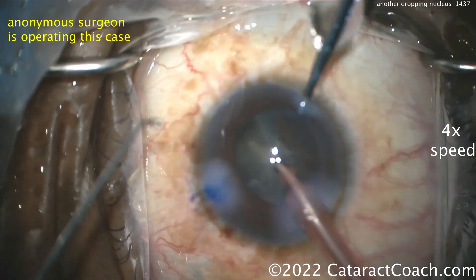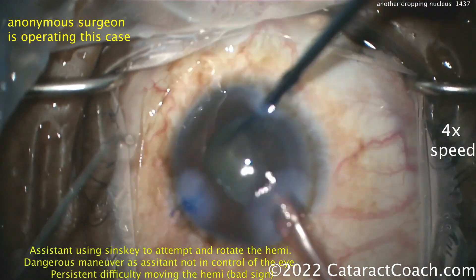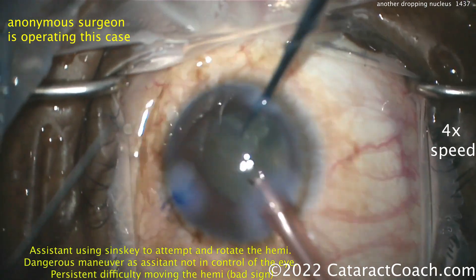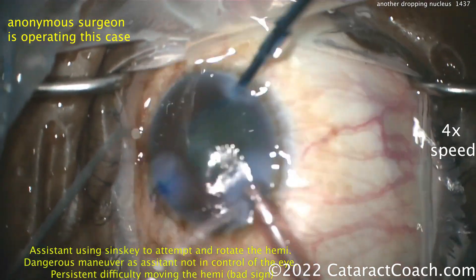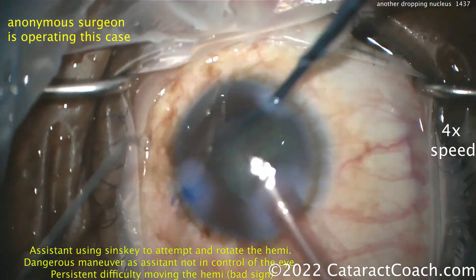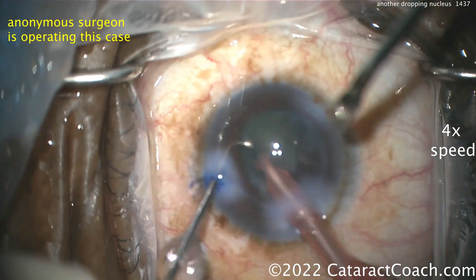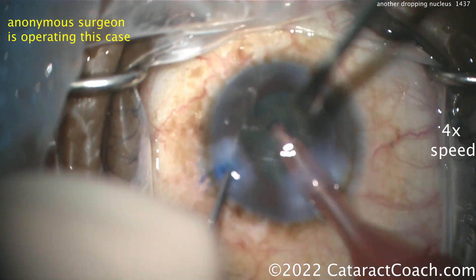Look at that red reflex too — it's a little too clear. The assistant now uses a Sinsky hook to help rotate the nucleus, but that's pretty dangerous since the Sinsky doesn't really control the eye. You still can't move that nucleus around, so that's not the greatest idea. At four times speed you can see just how much movement there is.